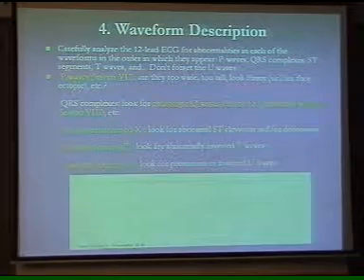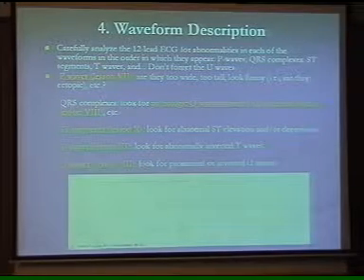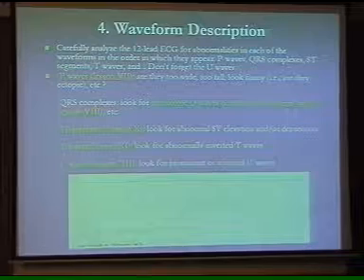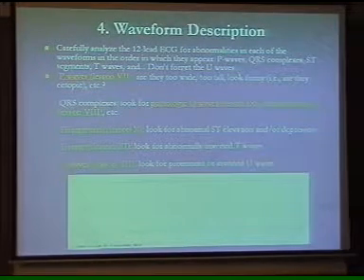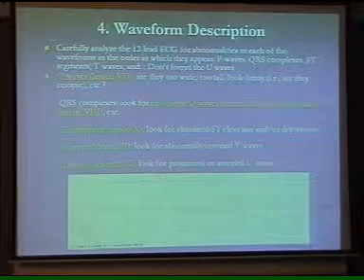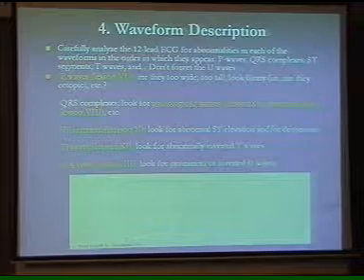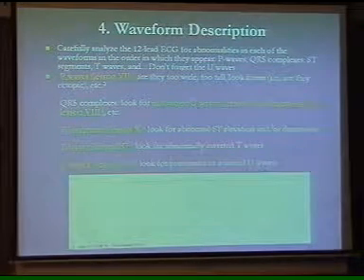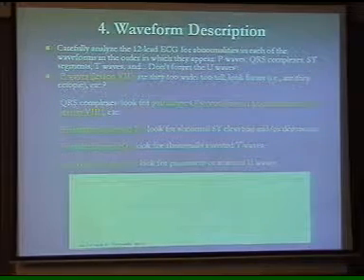Now, P wave. Basically, how you look at the waveform. This is very practical. What we've done so far is to look at the ECG as an electrical summation of forces coming from the heart. They give us very valuable information about the electrical activity of the heart as it happens. We have identified P waves, QRS complexes, and T waves.